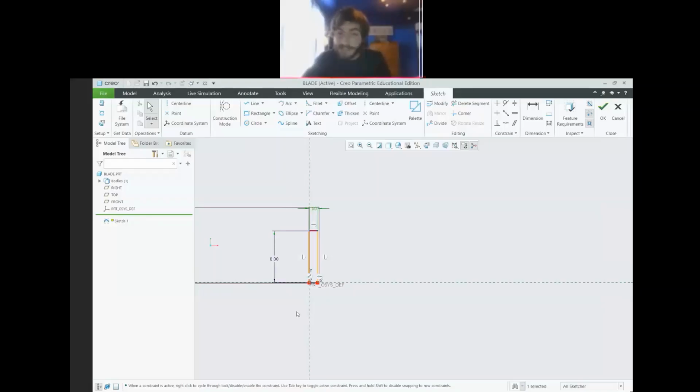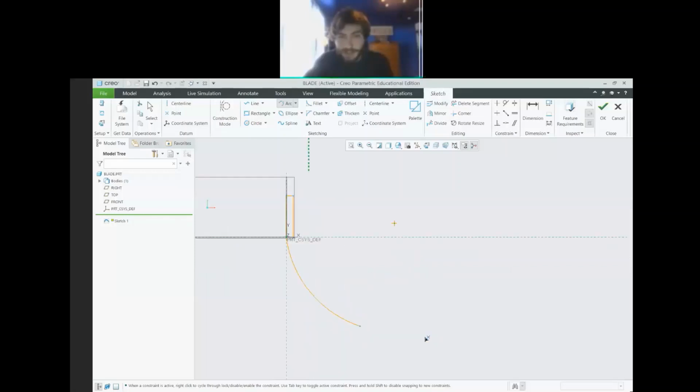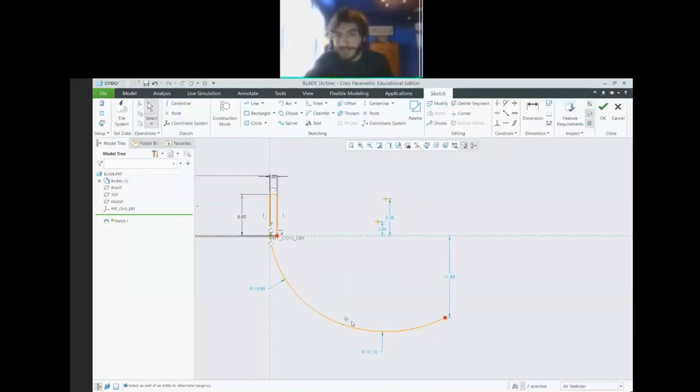From here, we can do more of a rough sketch, now that Creo has a general sense of our scale. When we add dimensions later, it's not going to yell at us. So we can go ahead and create our arcs. Something like that would be maybe our first arc, and there's probably some sort of compound arc in there, so we can create a second arc. We have one there and one there. I'm going to pause and let anyone who's working on it catch up.